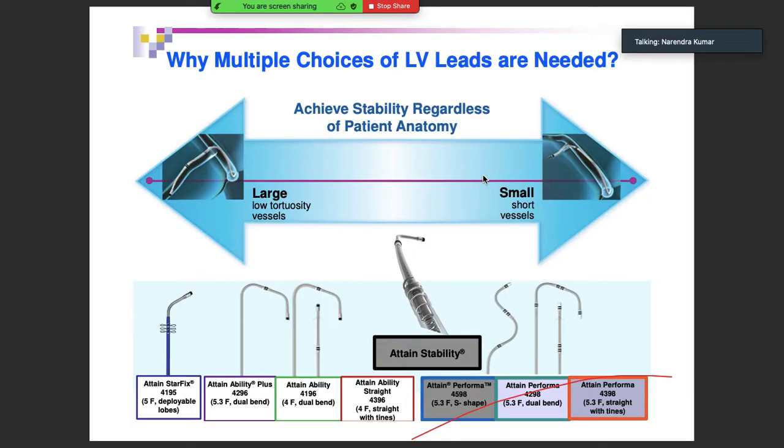And always we should have some precautions in mind, in the sense that changes in a patient's disease or medications may alter the efficacy of a device's programmed parameters, and the patient should avoid sources of magnetic and electromagnetic radiations to avoid possible under-detection and or inappropriate sensing and or therapy delivery, tissue damage, or even induction of the arrhythmia. And always do not place transthoracic defibrillator paddles directly over the device, okay?